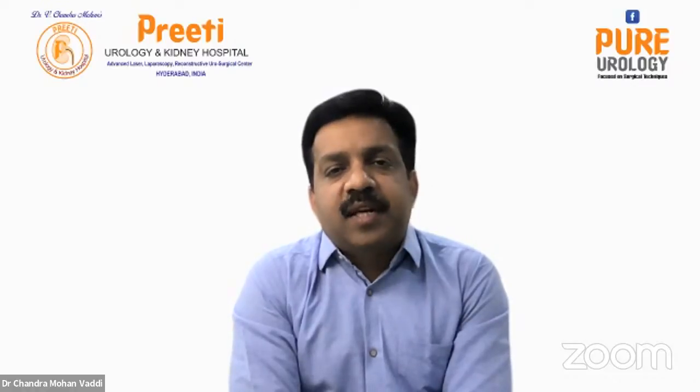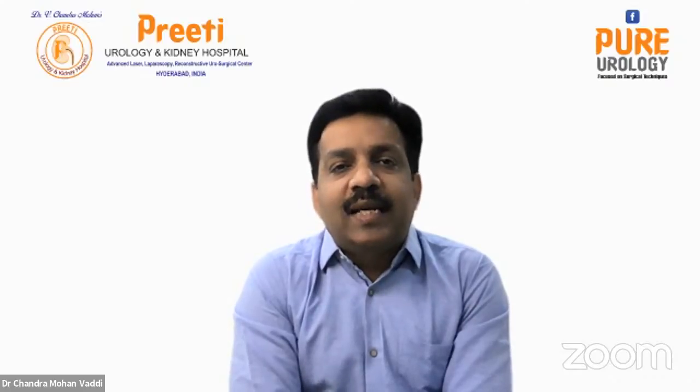Dr. Kwon, I wanted to ask you, when the ureter is tight and you cannot do flexible ureteroscopy, do you proceed only with multiple-tract PCNL, or what is your take on RIRS in tight ureters? In India, in 20 to 30% of cases we cannot do primary RIRS. We don't want to dilate the ureters. We want to put in a stent, come out, and do it at a later stage. What is your comment? Because a lot of juniors are listening.